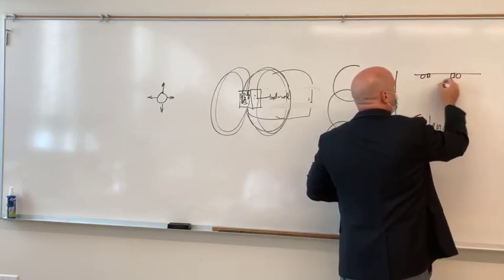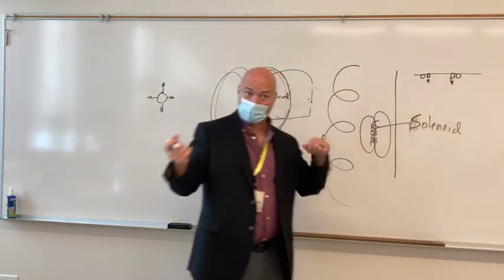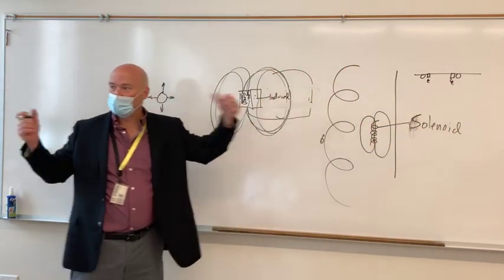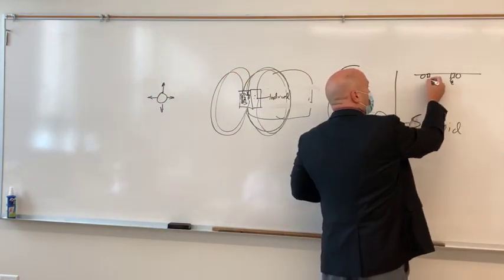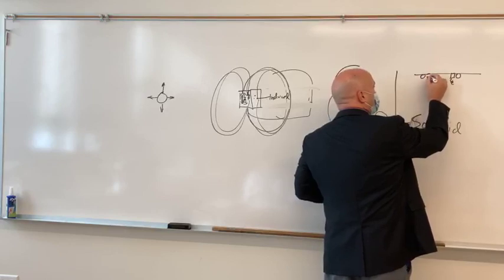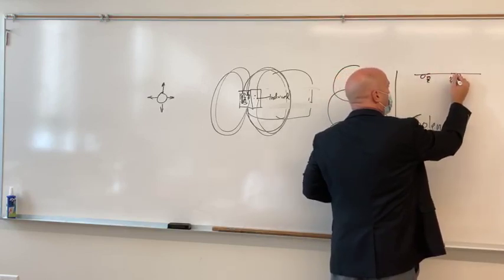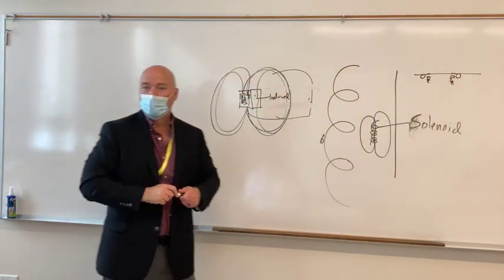Right below that brake is a solenoid, so when you want to take your tower somewhere else in the room, you press the buttons, and that energizes this to release the lock so the brakes are no longer on and you can drag that thing around the room and put it anywhere you want it to be.